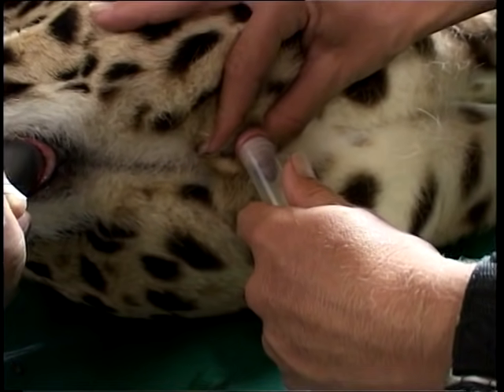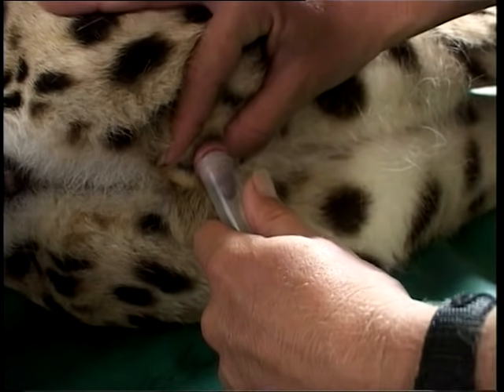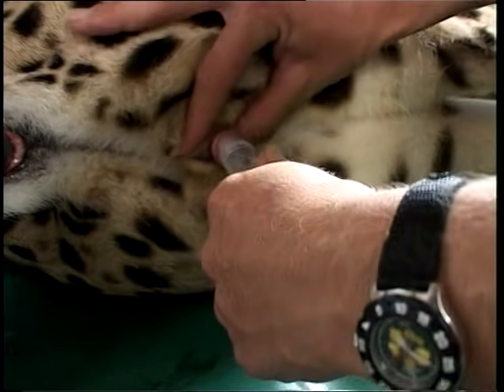We start off with a low-powered or low-voltage stimulus. So this stimulus that they see is not, people would interpret this as pain, but this is just the nerves being stimulated. That's right, yeah. Due to low voltage current. That's right. And the animal is unconscious because of the drugs that we use to immobilize it. So there's no sensation of pain at all.